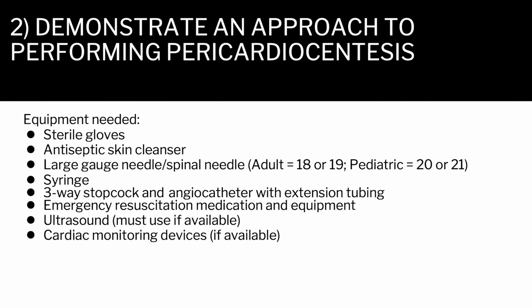It is helpful to have both a small 5 to 10 ml syringe and a large 20, 30, or 60 ml syringe, a 3-way stopcock and angiocatheter with extension tubing, and emergency resuscitation medication and equipment. If available, an ultrasound must be used, as well as cardiac monitoring devices.